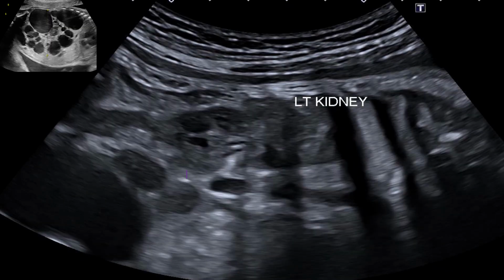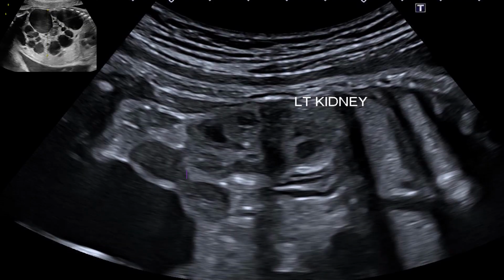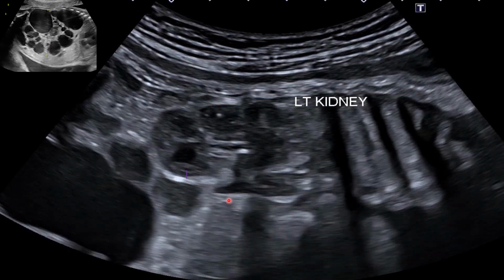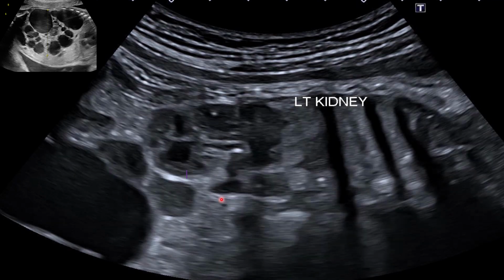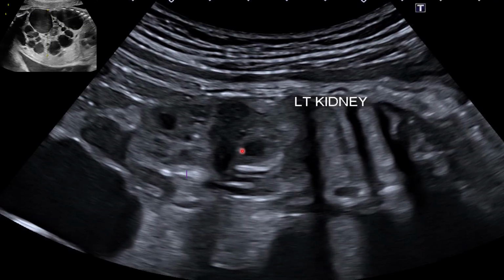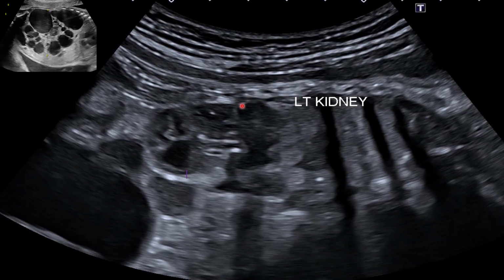These are not just images. This is diagnostic material. This is diagnosis. These images tell a deeper story than you might think by merely taking images and thinking that is enough. No, you have to check the renal pelvis for dilations. You can also check for hydroureters. So this is a very nice, well demonstrated kidney.